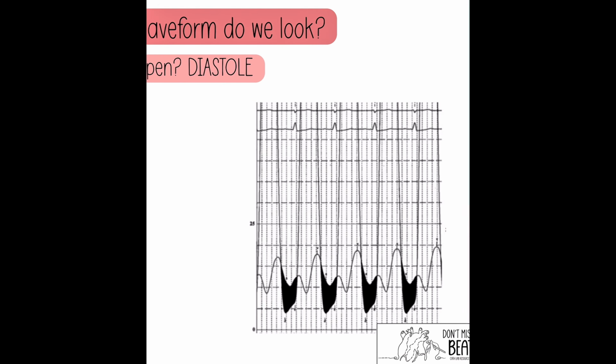Now, this is a little different. We're looking in diastole of 2 waveforms that have drastically different pressures, right? Your LV pressure is like 120/9, so that's usually on a 200 scale, so you can see the systolic peak. And then your pulmonary wedge pressure waveform is in the 10s, right? So that is going to be on a 25 millimeter mercury scale. Could you put this on a larger scale? Yes, you want it on this smaller scale so that you can see the diastolic pressure really, really well, and it's not totally zoomed out where you can't see anything.